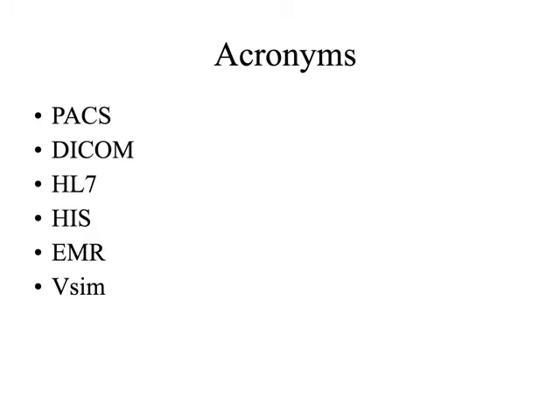So a lot of times it carries patient information from the HIS, right, or the EMR. And more commonly, I hear it called EMR. And are y'all familiar with the EMR that they use at your clinical sites? What EMR are they using? Are you talking about ARIA? ARIA. Medical record ARIA, yeah. ARIA is y'all's medical record system.